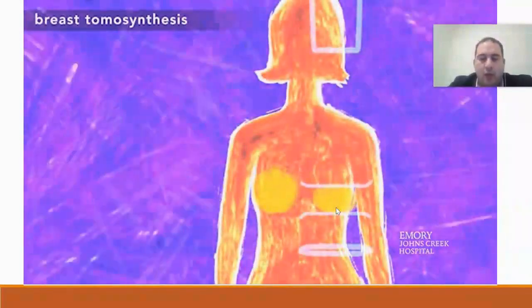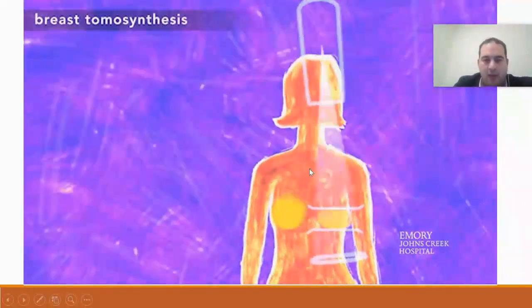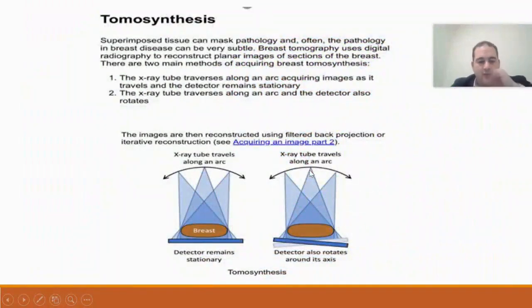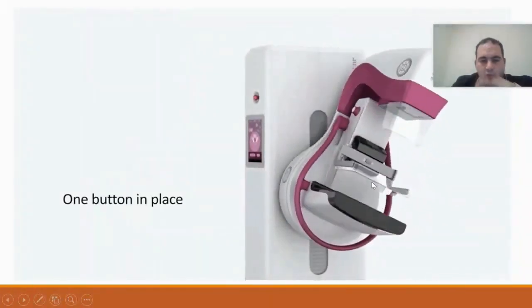This, of course, depends on the protocol of the place or the protocol used for imaging, especially if you have a specific detail you want to see in your image that is present in the devices available. The angle present, for example, as I mentioned, in some machines is from 15 to 15, and in some it is from 25 to 25. Of course, this is also among the features in the machines that you might be aware of, and it will definitely make a difference, especially in the cost or price of the machine itself. All right, this is, for example, what is available.